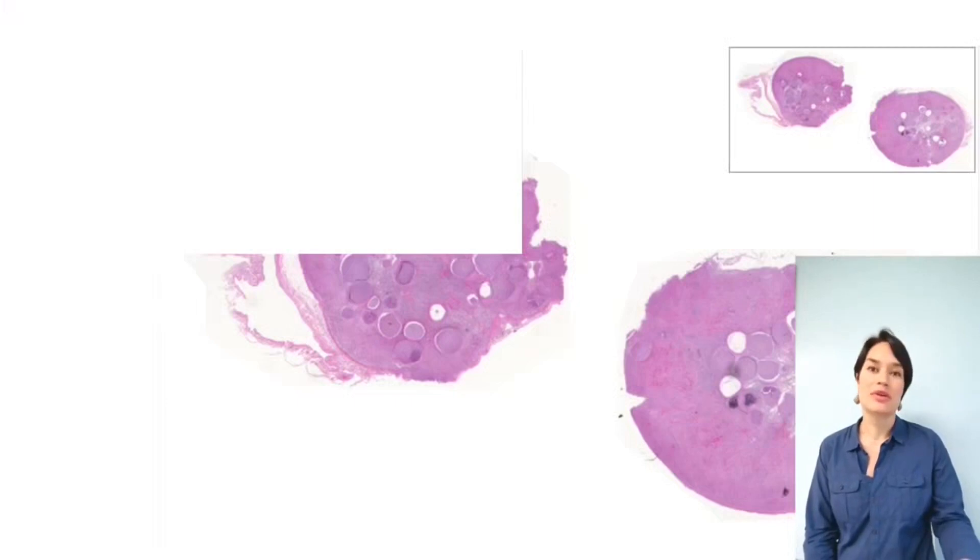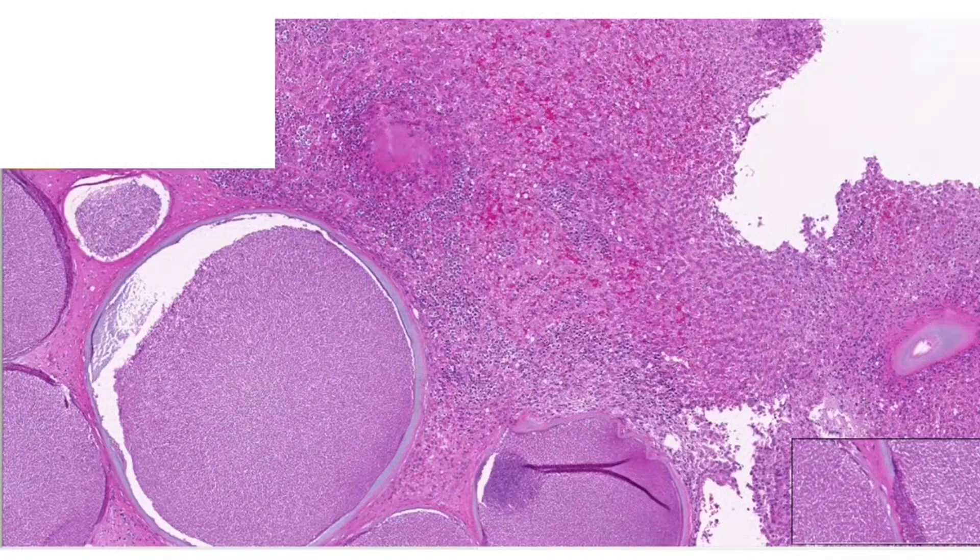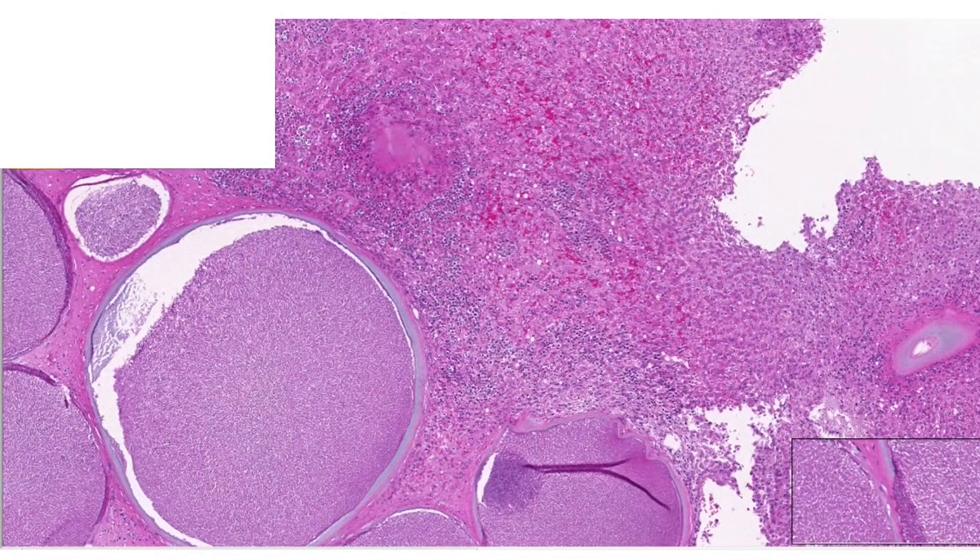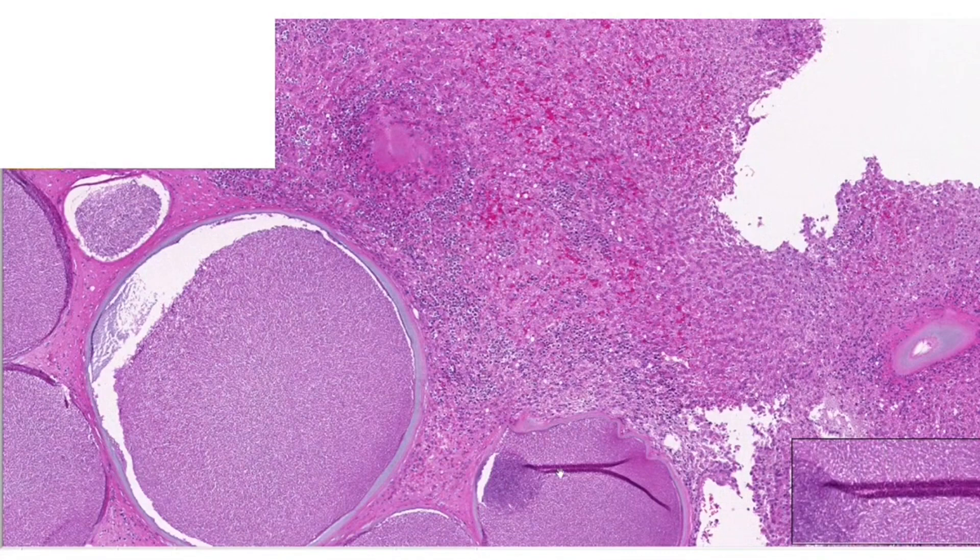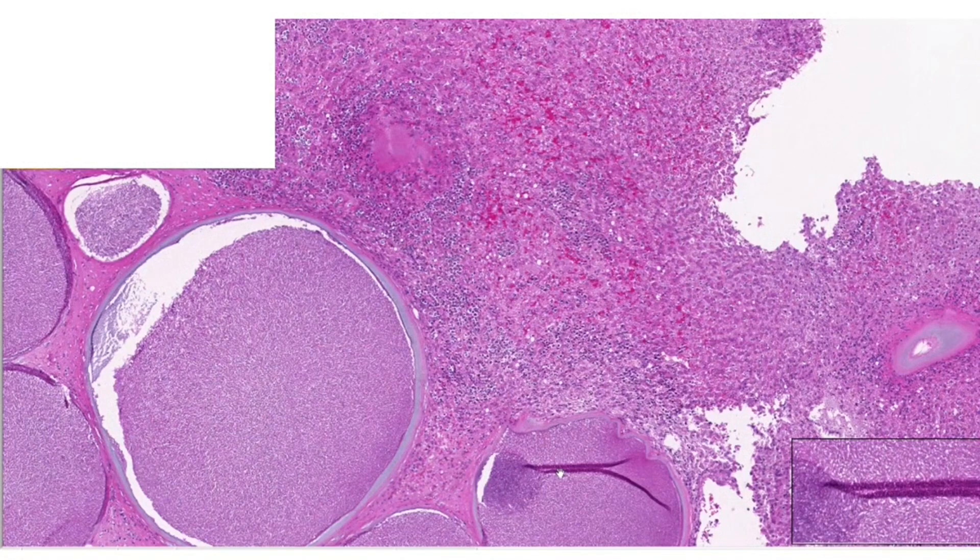We are in the Aperio ImageScope. I'm going to put the link for download in the video notes. Aperio ImageScope is a classic, meaning this is probably the first viewer for whole slide images. So if you are a computer scientist and you are designing a new viewer, please go ahead and check what it has so that you don't reinvent the wheel.